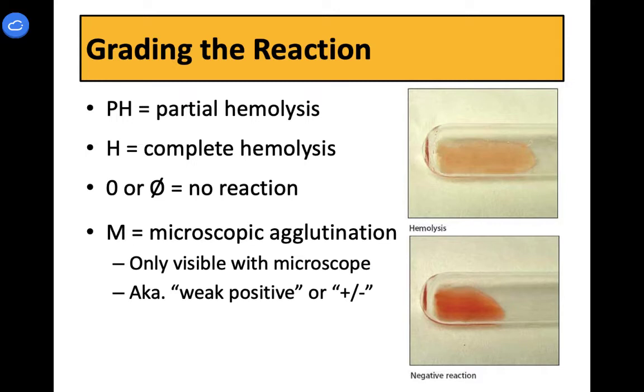This is also showing that sometimes you have to look under a microscope to see it. It can get really super fine. We're not going to do that, but that is something that can happen.